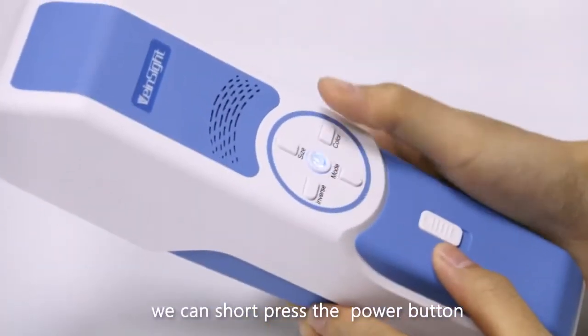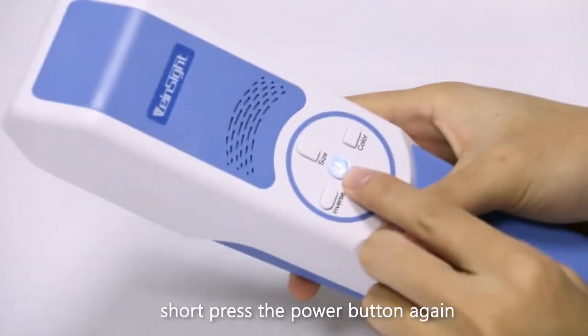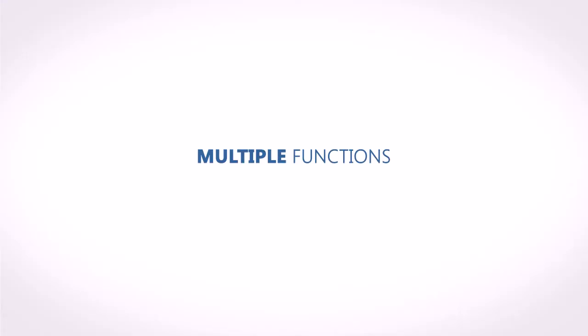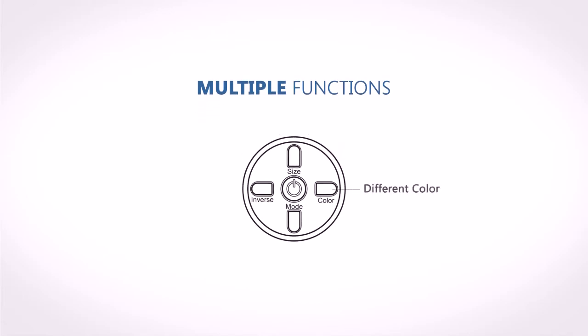The VS 400 has a standby function. To enter standby, short press the power button when the machine is powered on. In the standby state, short press the power button again to wake up the device.